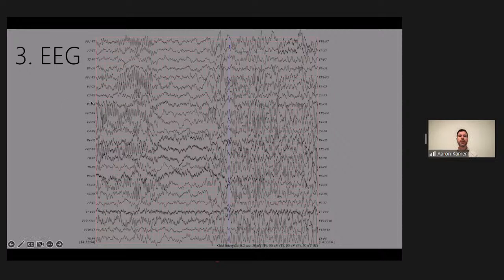And they're using the different waveforms to try to figure out whether there is a seizure either actively happening because they've monitored the patient under video EEG, or if it's a more dormant region of the brain giving off some abnormal tracings because it's potentially epileptogenic and currently interictal.